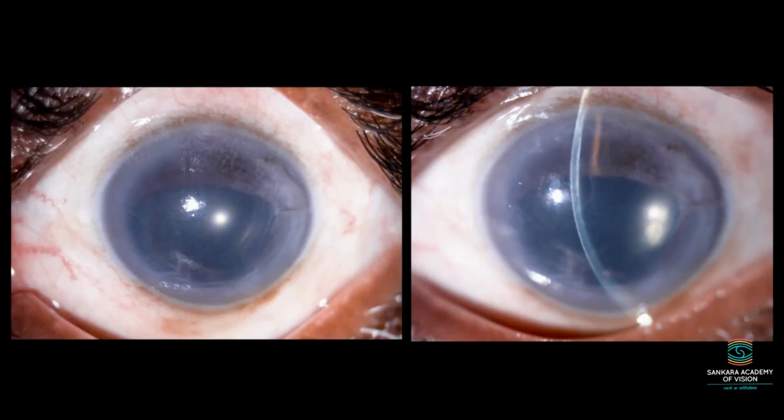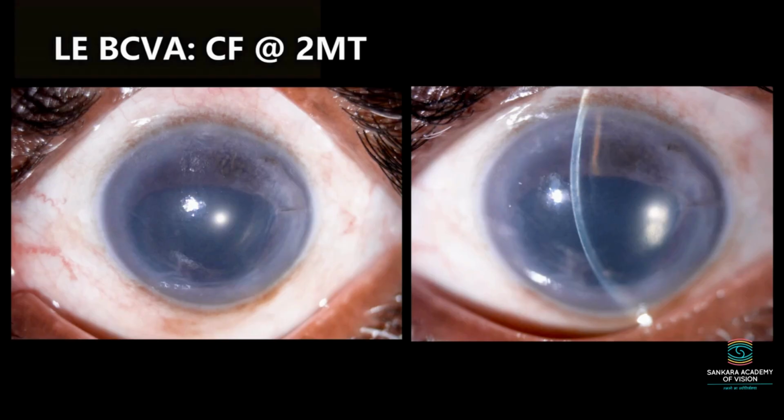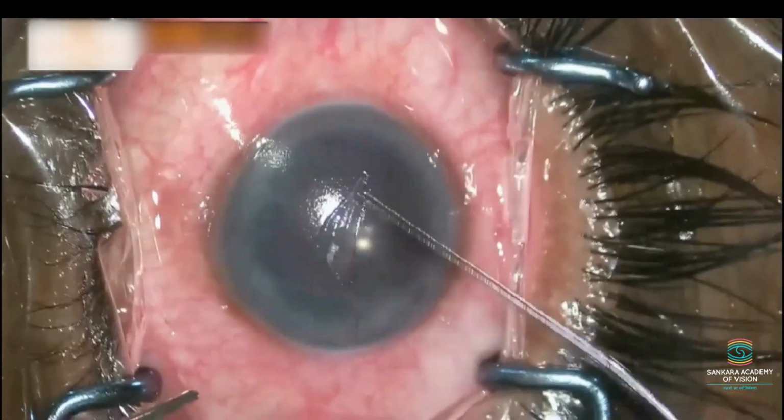So, this is a case of a 65-year-old male diagnosed with left eye pseudophakic bullous keratopathy, having a visual acuity of counting fingers at 2 meters. The patient had a poor view of antechamber, associated peripheral anterior synechiae from 3 o'clock to 9 o'clock hour, and fixed mid-dilated pupil. The patient was planned for Descemet membrane endothelial keratoplasty.